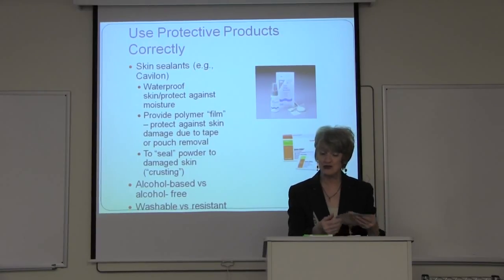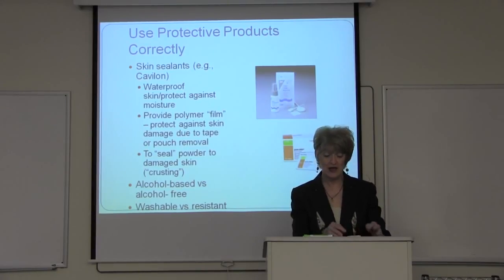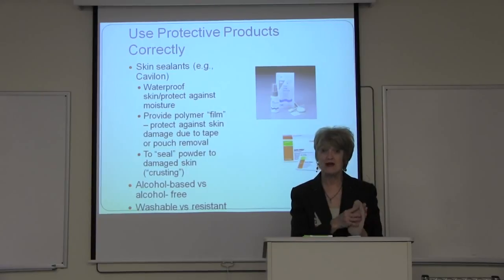So you have to use your own clinical judgment. I just wanted to point out that that's why companies will sometimes tell you that, and I understand where they're coming from. But as a clinician, I know that in many situations I actually get a better seal when I put down the skin sealant first and then put the pouch on top.